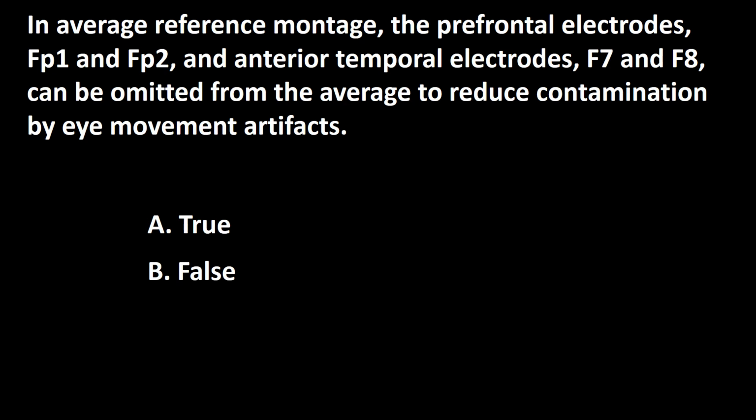Next question. In average reference montage, the prefrontal electrodes FP1 and FP2 and the anterior temporal electrodes F7 and F8 can be omitted from the average to reduce contamination by eye movements artifacts. A true, B false.